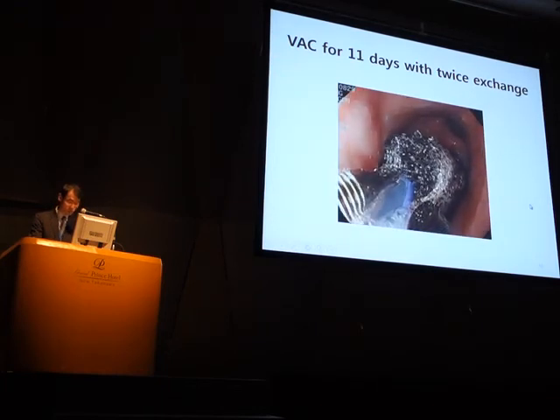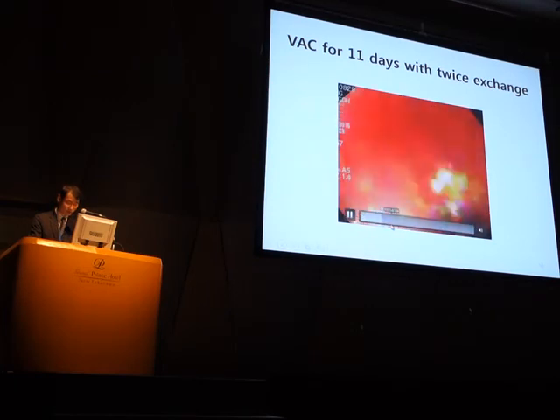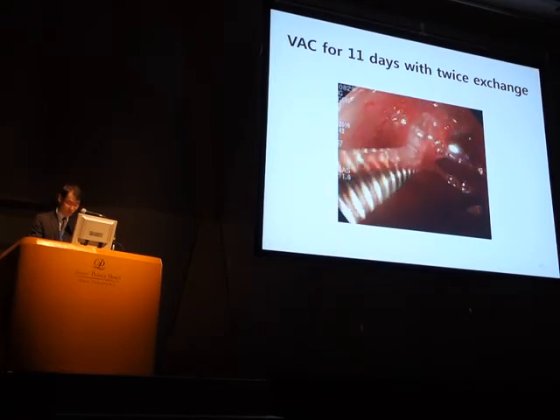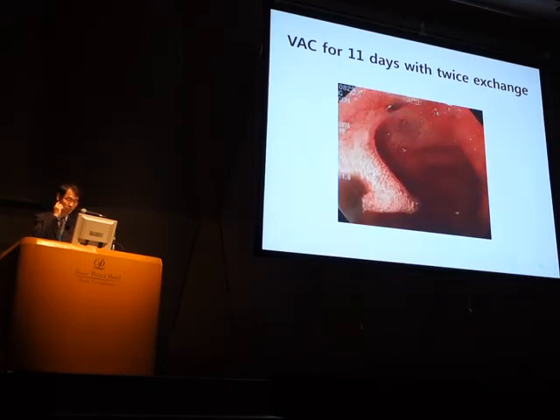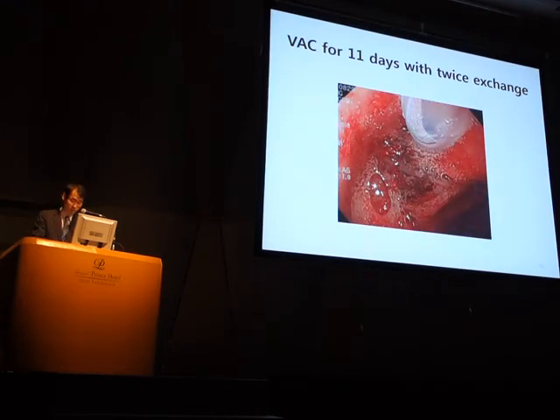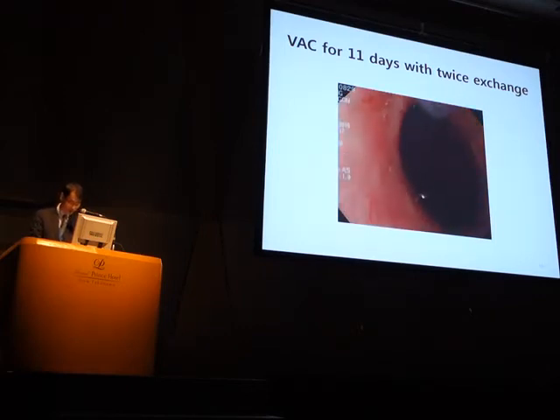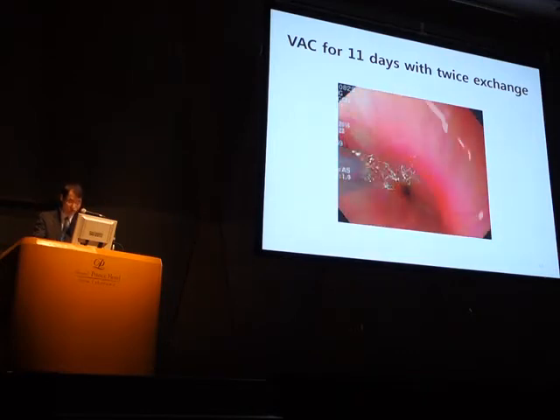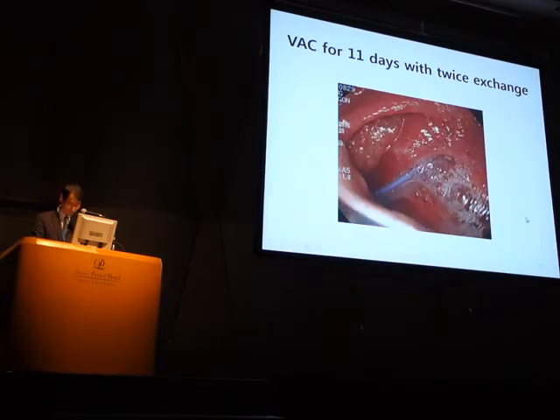After introducing the sponge into the stomach using grasping forceps, it can be inserted into the wound cavity using forceps. When the opening of the cavity is small, it is difficult to insert the sponge into the cavity, but the endoscopic vacuum treatment is more effective when the opening size is small. Lastly, it should be checked whether the tube is twisted in the oral cavity.